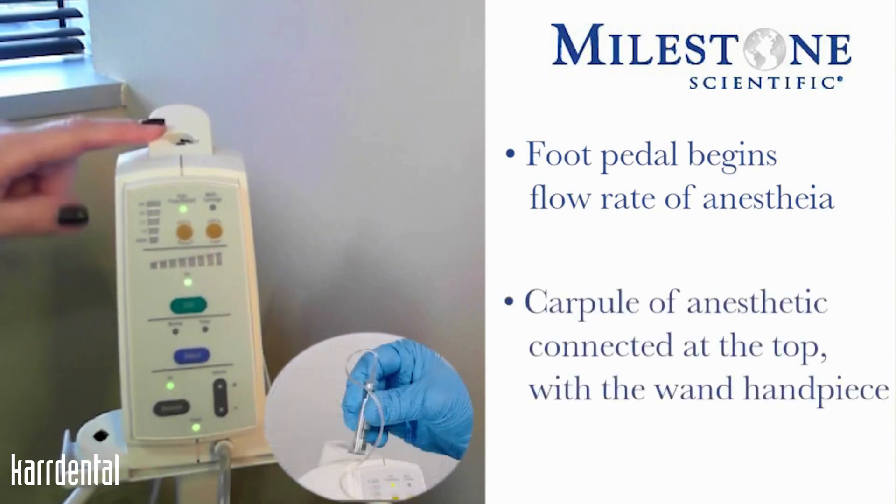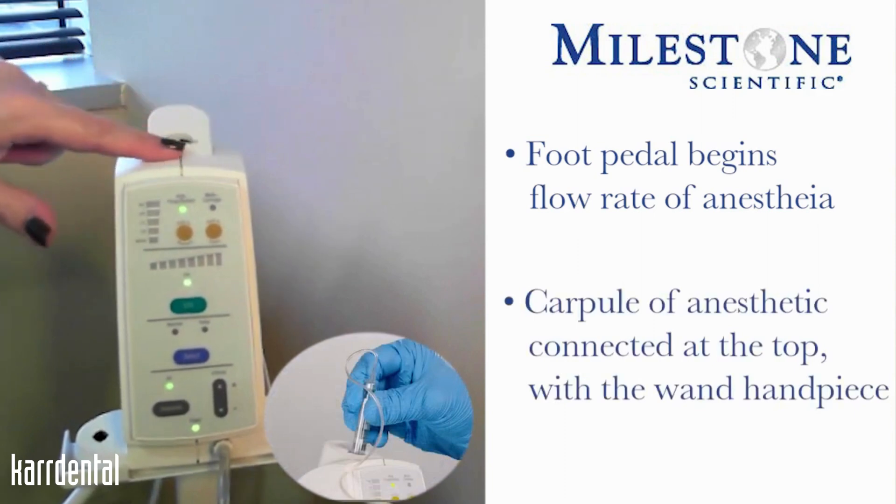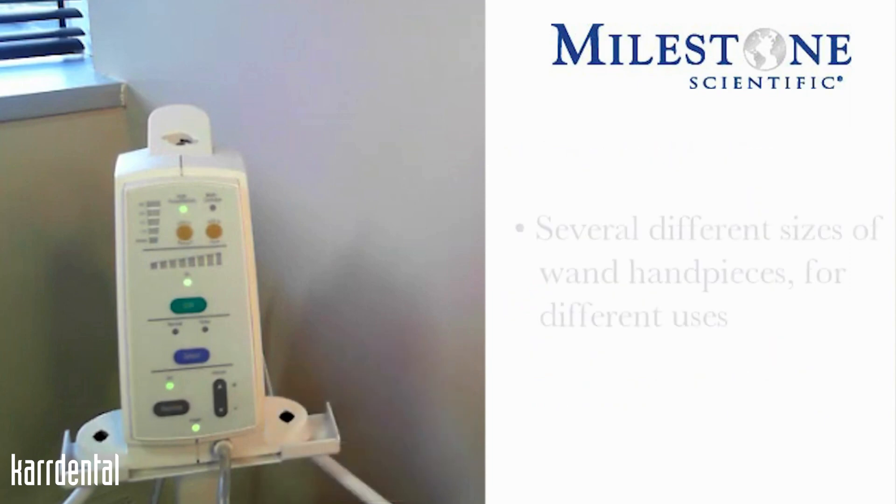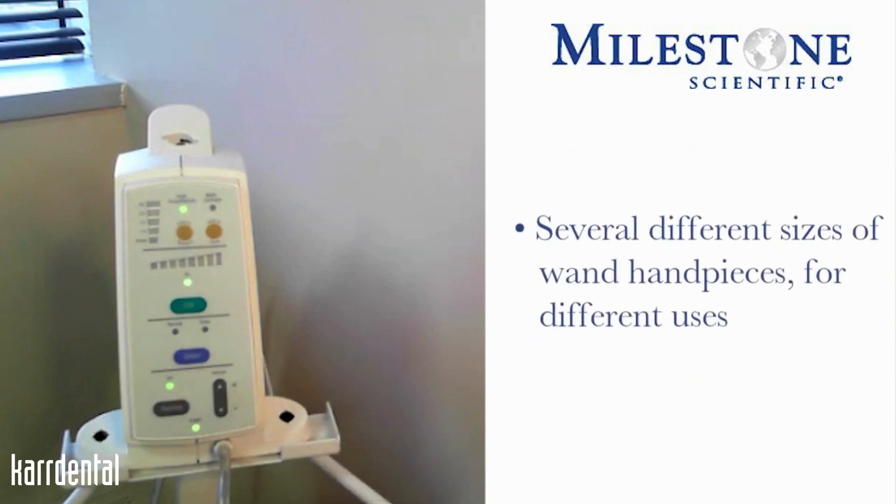The carpule of anesthetic will be engaged into the top part of the instrument itself with the wand handpiece. There are several different sizes of wand handpieces determined by the injection technique that is being done.